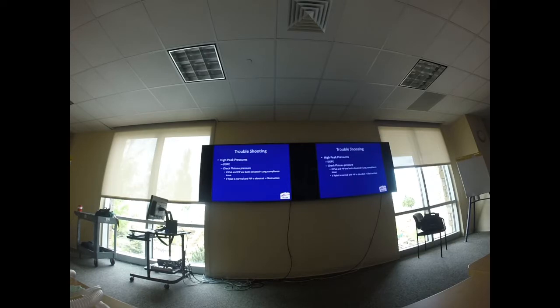All right, so let's troubleshoot it real quick. So, high peak pressures. Do you guys use the DOPE mnemonic? It stands for displacement, obstruction, pneumothorax, or equipment failure. I use the DOPE mnemonic a bunch with the ventilator. It starts to alarm, and I go through the DOPE mnemonic. So is my tube displaced? Maybe it's down the right main stem, and I'm only ventilating one side. That would definitely increase my peak inspiratory pressure, right?